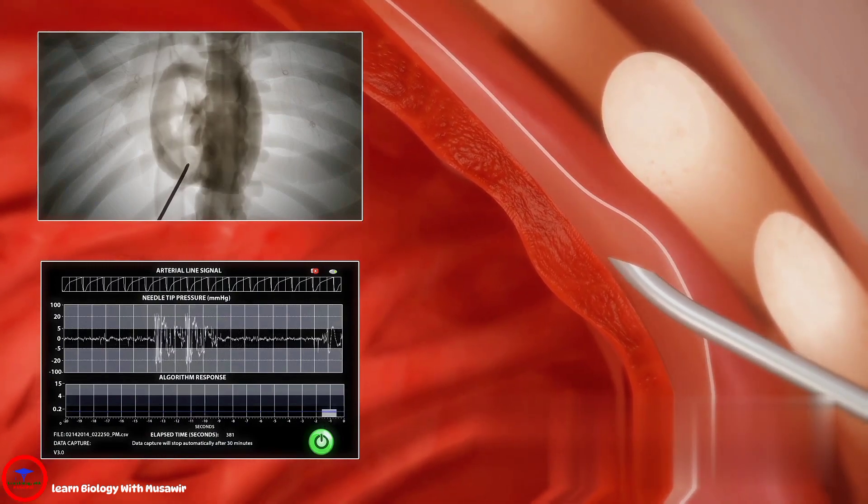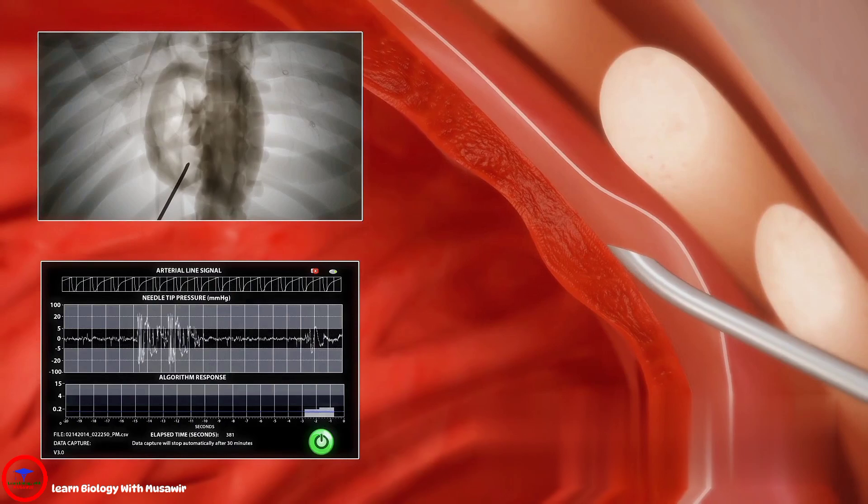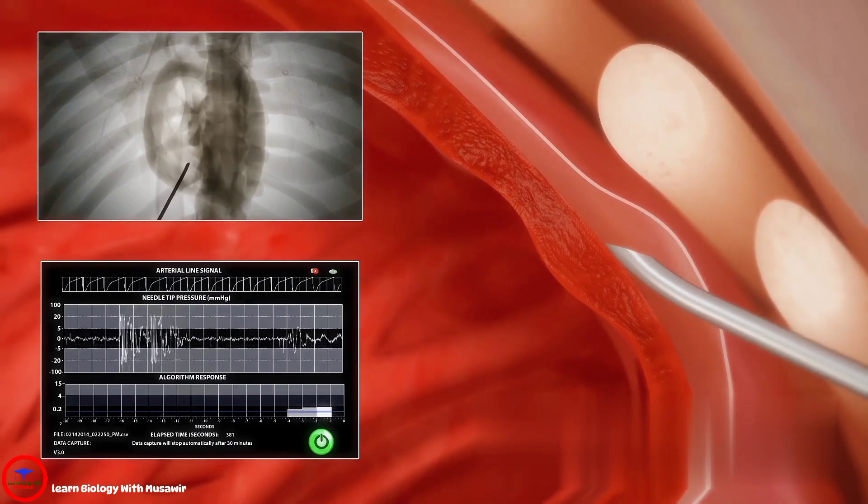Upon entering the pericardial space, the pressure monitor displays a real-time amplitude shift in frequency.